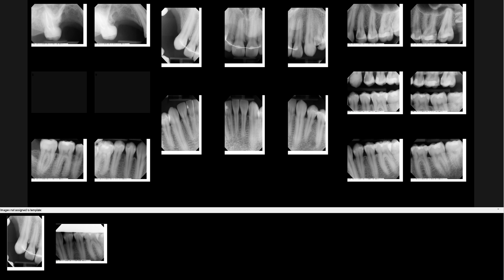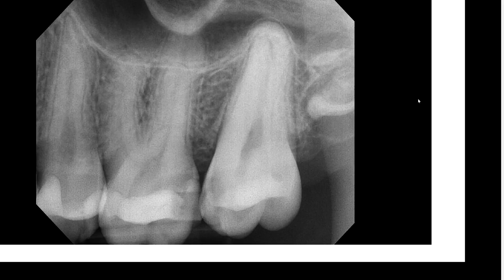I want to draw your attention to this maxillary posterior molar PA. We are seeing teeth 14 and 15, and with that we can also see the maxillary sinus. This is the zygomatic process of the maxilla and the border of the zygoma. And we see another diffuse radio-opacity that extends superiorly, and that is the coronoid process of the mandible.